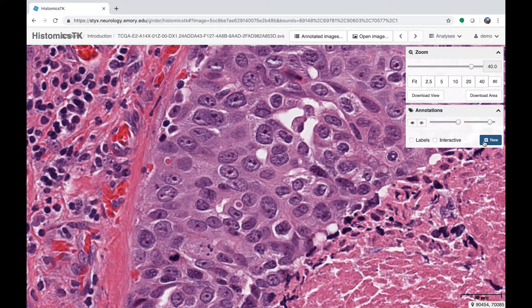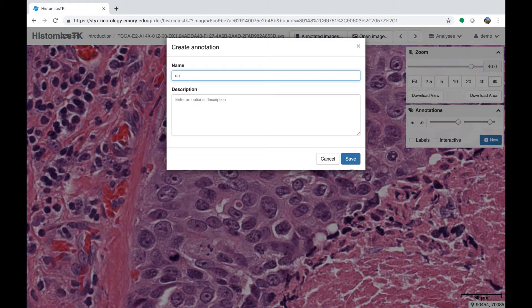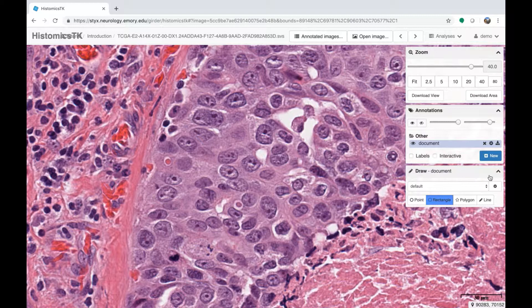In the upper right corner, below the magnification panel, there's an annotation panel where we manage annotation documents and control global display properties of annotations. Go ahead and click New to create a new annotation document — enter the document name and description. After doing this, you'll see a folder icon appear in the annotation panel that says Other, because we don't have any styles yet. Underneath that folder icon is the document that was created.